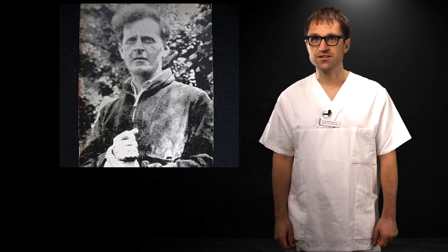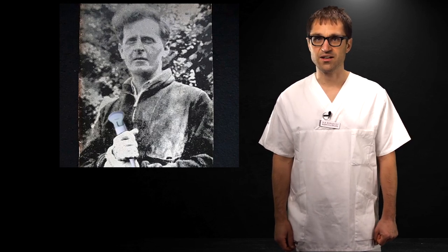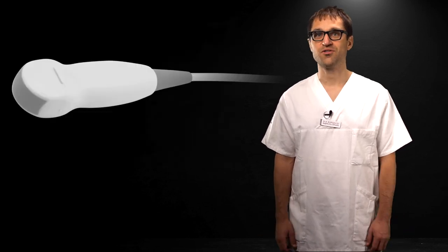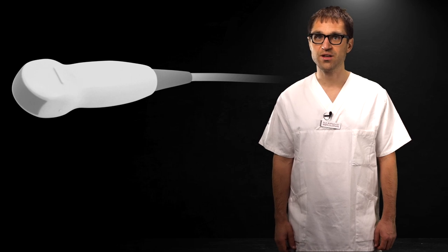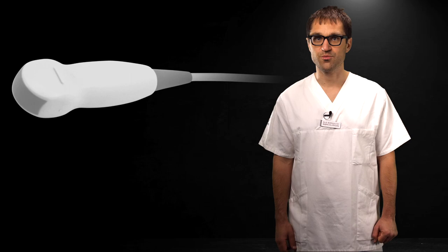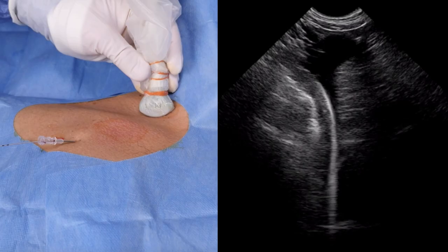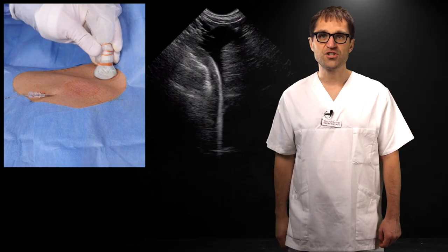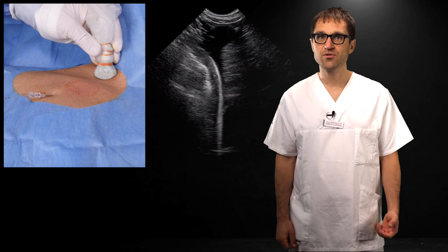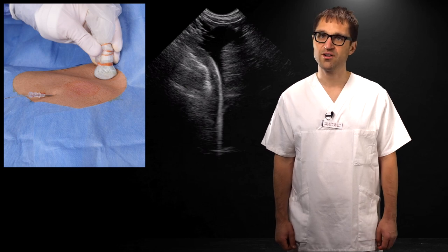Now Ludwig Wittgenstein wrote that one can't see into another's heart, but he clearly didn't have access to a microconvex probe. These beauties are perfect for central lines. The resolution is okay, but they can see much deeper compared to the linear probe, and they have a really small footprint. These properties allow for the amazing supraclavicular fossa view as described by Kim and colleagues. We visualize and place the guide wire into the desired location in real time. Sometimes you can pull this off with a linear probe, but not as easily.